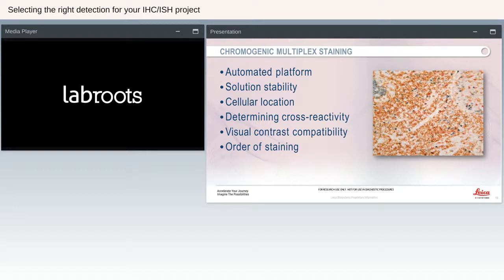We've got probably a FOXP3 or TBET and a KI67, I believe, at the time, on Bond RX. This took me probably a few months in development. This is on a human tonsil, so this was just my test run here.